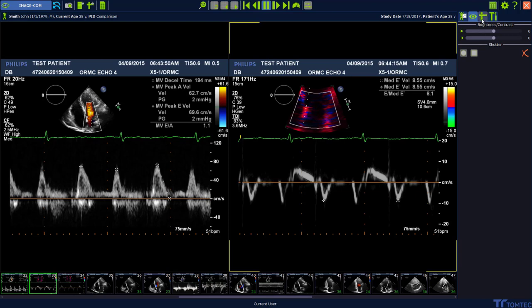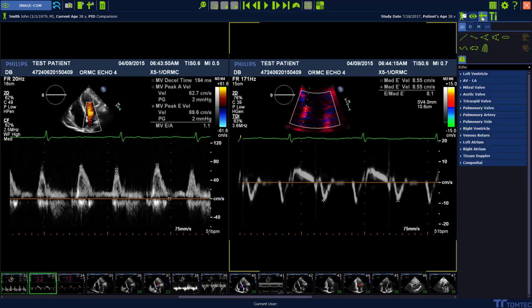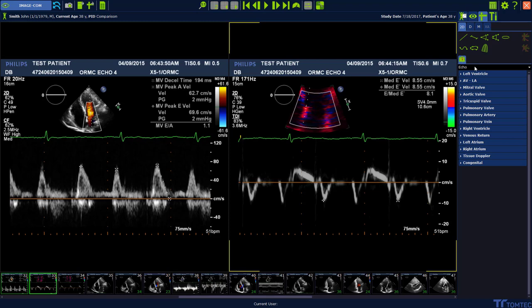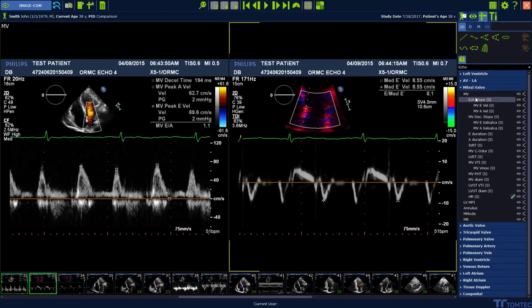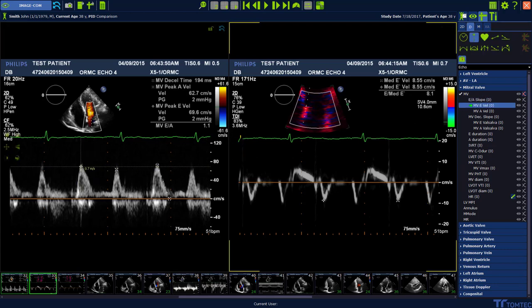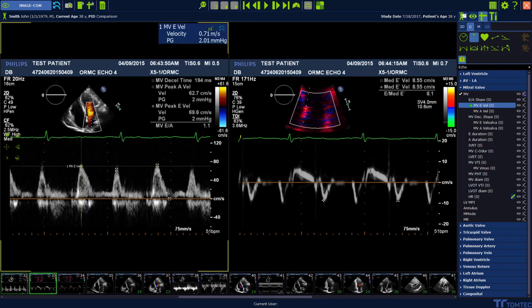To measure the E to E prime, move to the measurement tab on the top and select the exam type echo. Select the Mitral Valve package followed by the sub-item MV. Choose the MV E velocity, move into the image and measure the maximum E velocity.